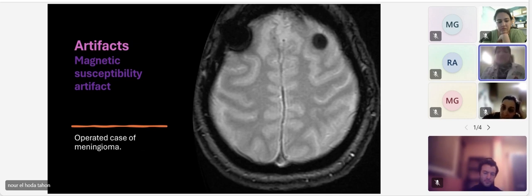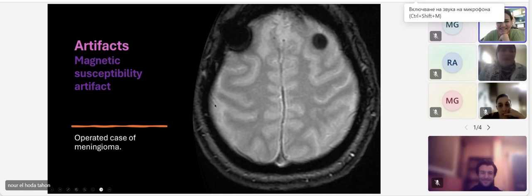You have images to read, but sometimes you cannot read them and they're non-diagnostic because of artifacts. And I think anyone who works with the BraTS suffers from artifacts in some images. Is this correct? Yes, exactly.